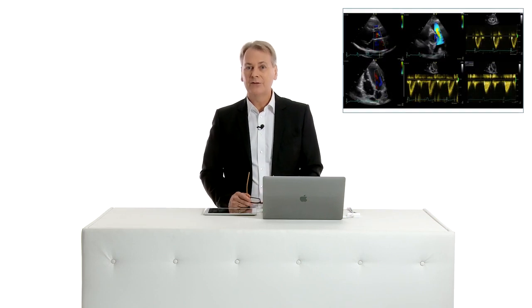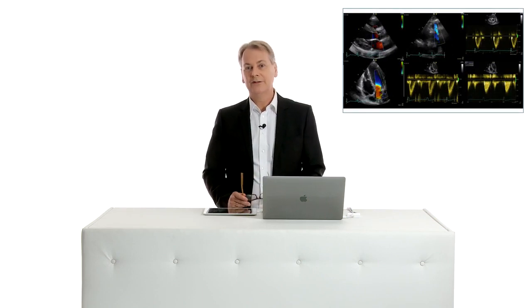When spectral Doppler was introduced into clinical practice, a lot of people actually said it's a useless technology. And I remember some people at our clinic refused to use it. And then it became clear that with the help of Doppler, you could actually quantify lesions.